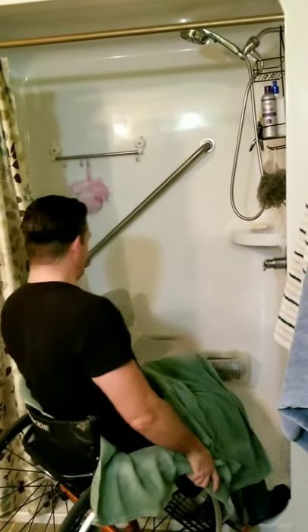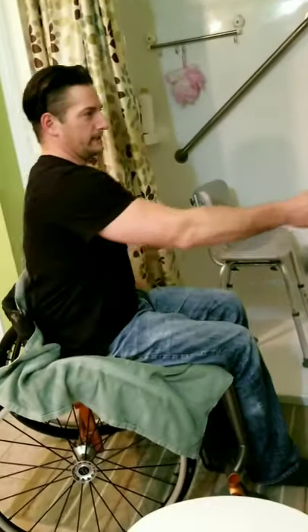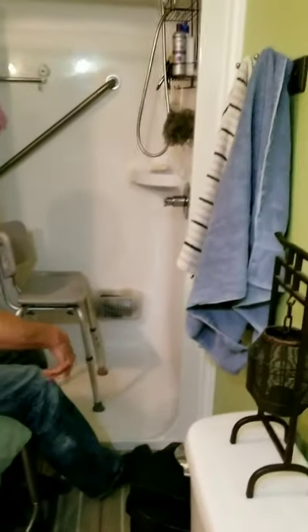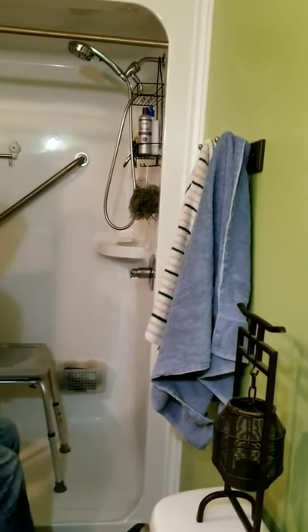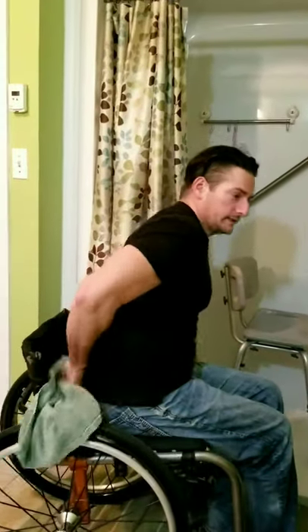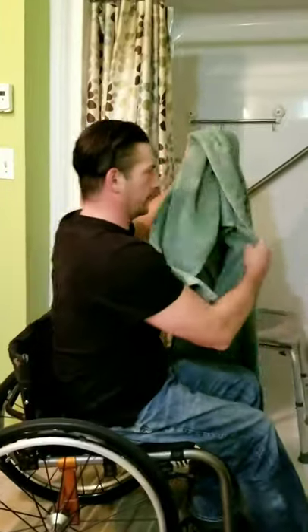Then I'll flip the towel and dry off the rest of my body. I always have a second towel here too so I can dry the bottoms of my feet with another towel. Then I do a little hop to get the towel off and hang it back up.